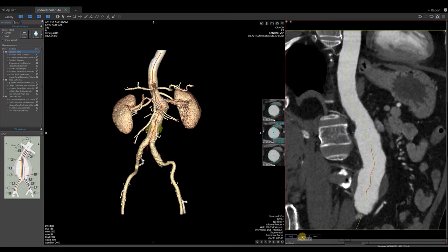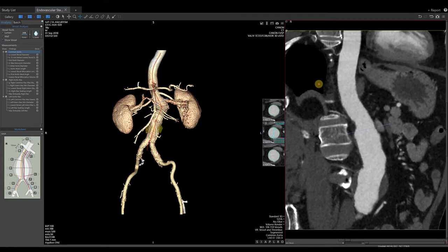To start over, hit reset. When finished, whether saving changes or not, select the close button. Next, verify the software has captured the contours of the lumen accurately. Once again, right-click in our CPR image. This time, select the second option, Edit Contours.